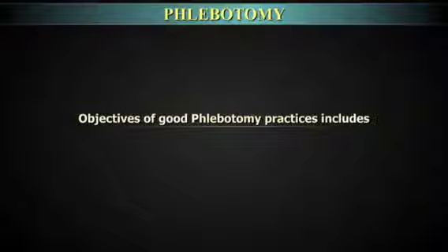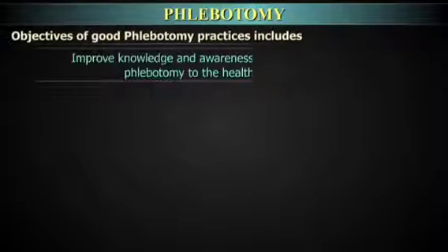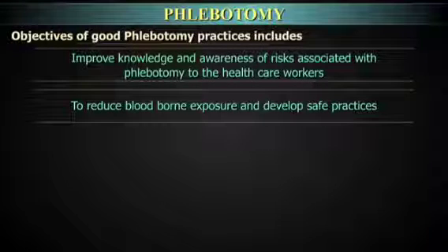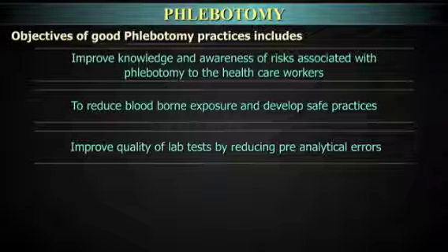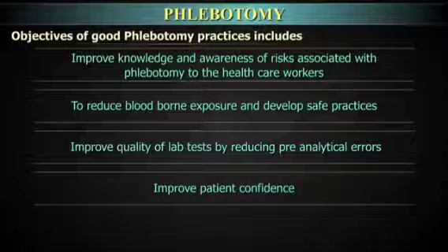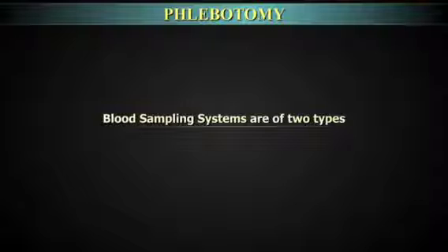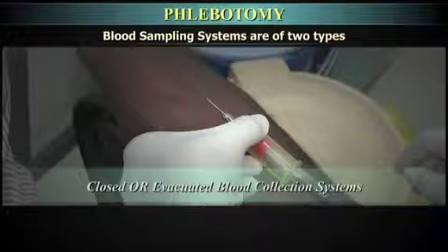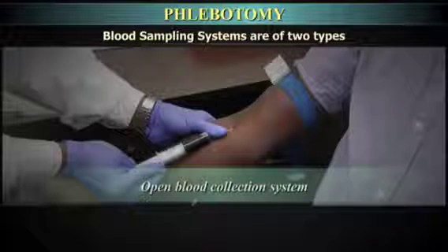The objectives of good phlebotomy practices are to improve knowledge and awareness of risk associated with phlebotomy among healthcare workers, to reduce blood-borne exposure and develop safe practices, to improve quality of lab tests by reducing pre-analytical errors, and to improve patient confidence. Blood sampling systems are of two types: closed or evacuated blood collection systems and the open blood collection system.